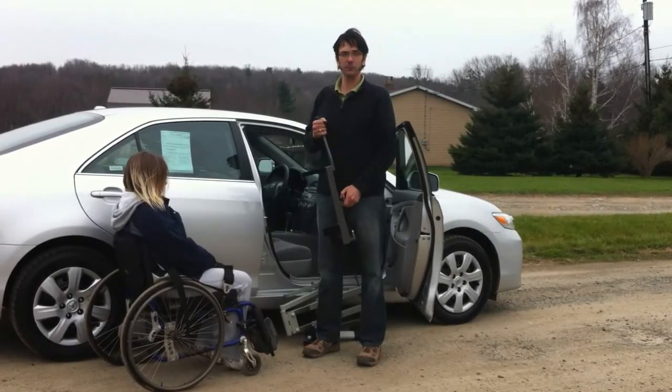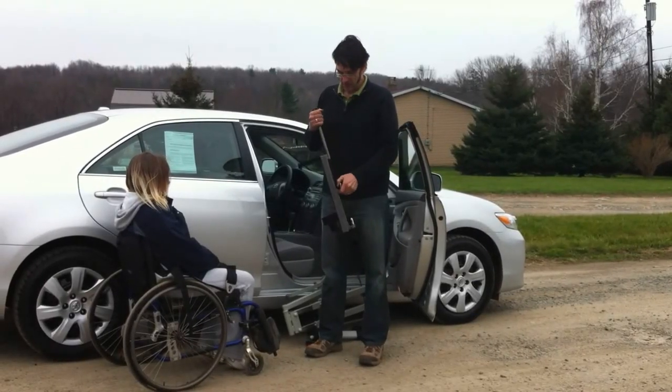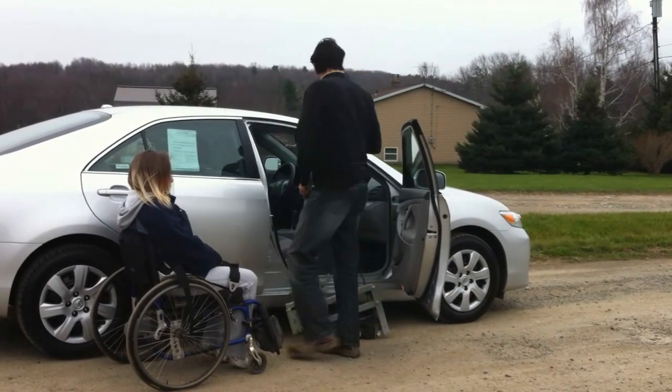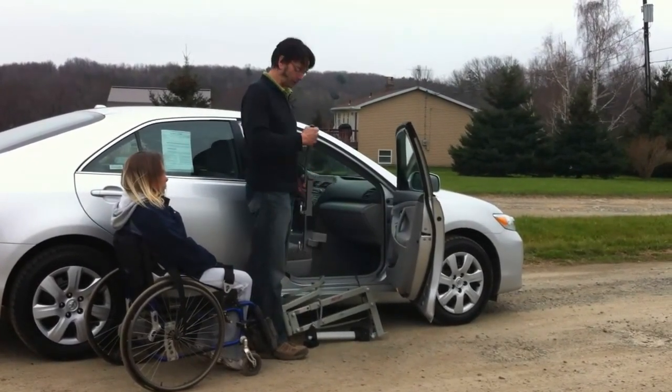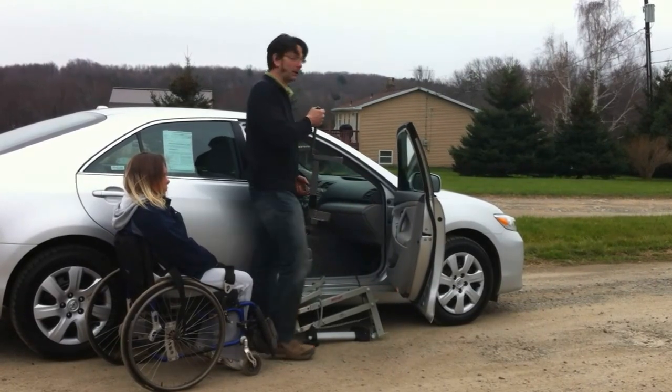This is the AXS Unlimited Multi-Lift with the Speedy Bar accessory. The Speedy Bar is a great new adaptation which allows you to install a Multi-Lift on virtually any vehicle with minimal or no modification.